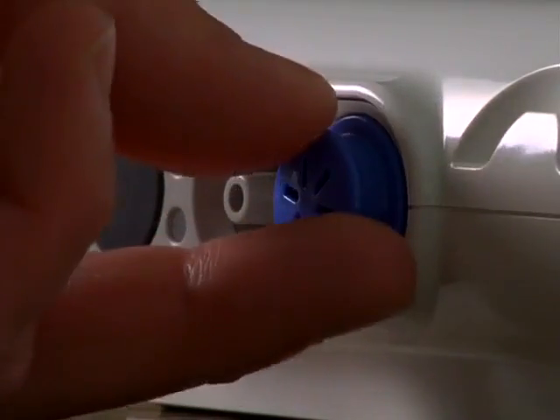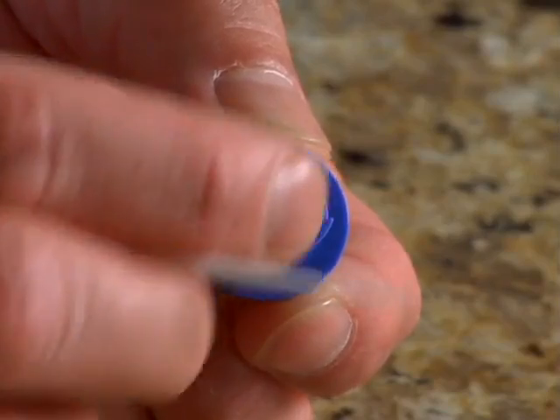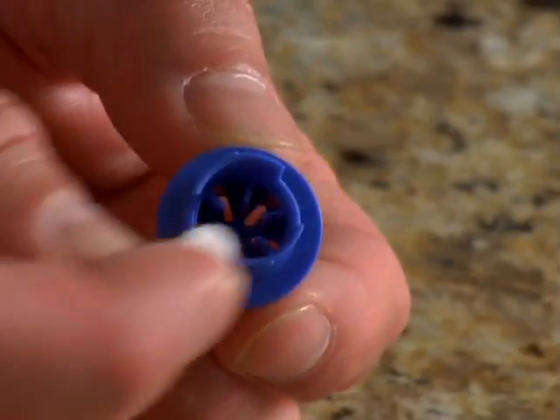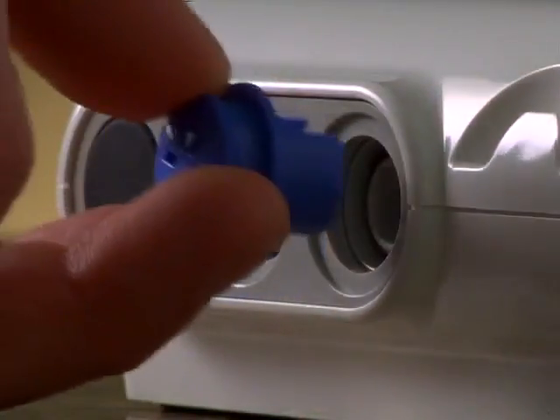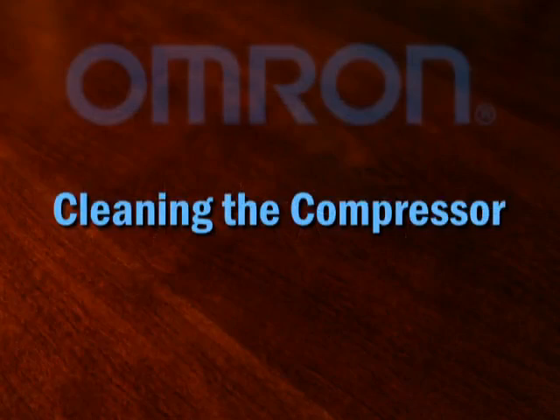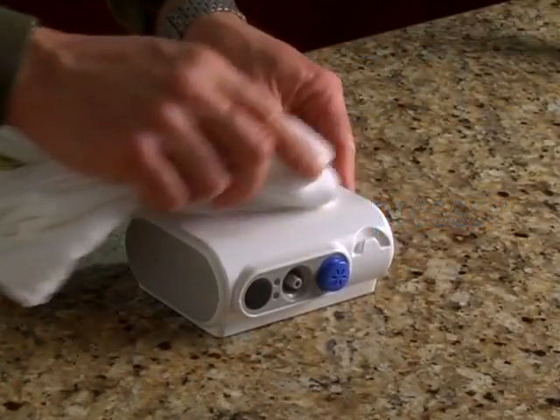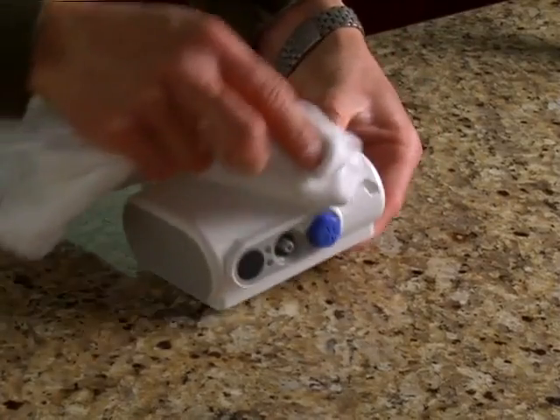Simply remove the air filter cover off the front of the compressor. Remove the filter with a pointed object like a toothpick. Insert the new filter — there is no front or back to it. Then replace the air filter cover. To clean the compressor, simply wipe with a soft, damp cloth. Never submerge the compressor in water.